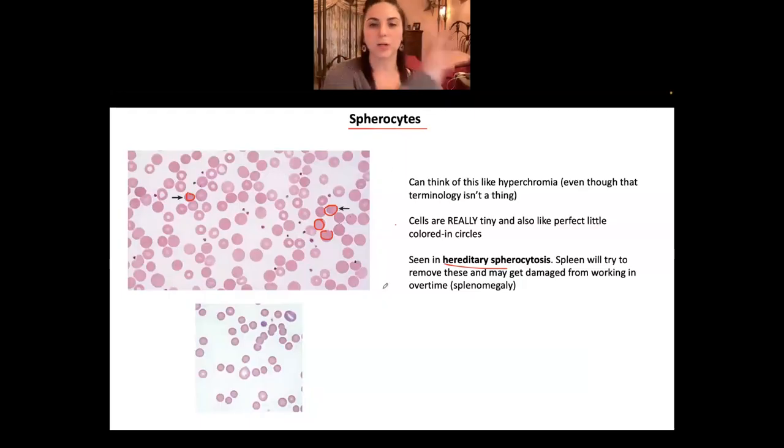So you can draw it back to this discussion with immunology, where the spleen removes these misshapen red cells. And here's another picture of spherocytes, and then here's a target cell. After splenectomy, do patients have to take certain medications to help against things like target cells? So something like a target cell is not that dangerous. The red cell is still able to carry oxygen, so you really don't give the patient anything to prevent it because it's benign. You're more worried about encapsulated infections after a splenectomy.